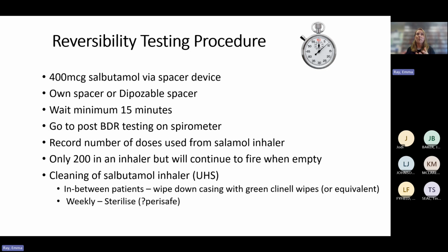we're going to have 4 puffs of the inhaler now, one at a time, and I'm going to shake that inhaler between each puff as well, just to remind you to do that. So what you're going to do is breathe out all the way. Pop your lips around the mouthpiece, start breathing in, nice deep breath in. When you breathe in, I'm going to press the inhaler, keep breathing it in all the way, hold your breath 10 seconds, and I'll count to 10. So 1, 2, 3, 4, 5, 6, 7, 8, 9, 10. I'll shake the inhaler again, and we'll do it all again. So 4 puffs of that.